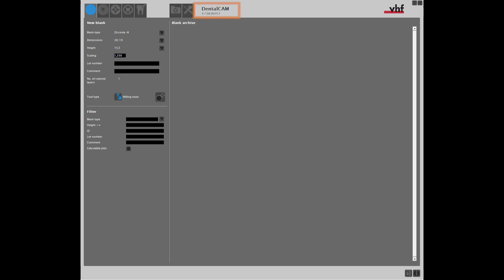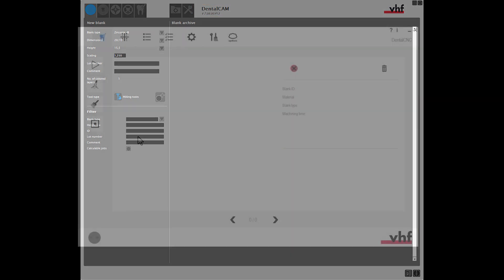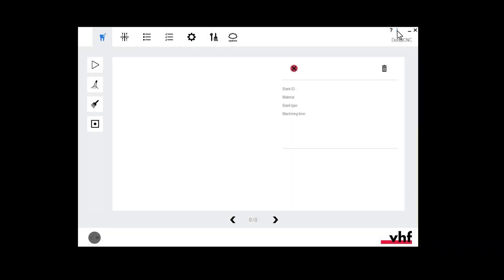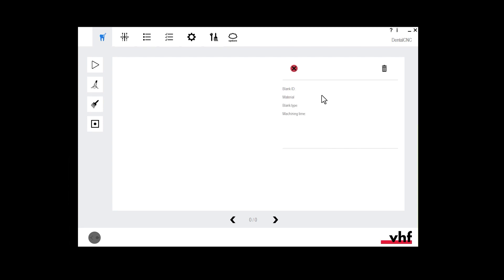If DENTAL CAM 7 is installed on your CAM computer, contact your service partner to license version 8. If DENTAL CAM 8 is installed on your CAM computer, update DENTAL CAM to version 8.07 or higher.